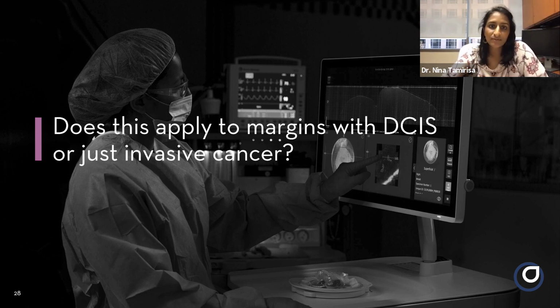Essentially, yes. So it does apply to DCIS and invasive cancer. As you saw in the case reviews, it really gives you a real-time assessment of disease at the margin. And so essentially, not just for positive margins, but as was seen, you can measure and see where your margins are close or technically 2 millimeters away for a sufficient margin for DCIS. So it really gives that ability to define where disease is at the margin.